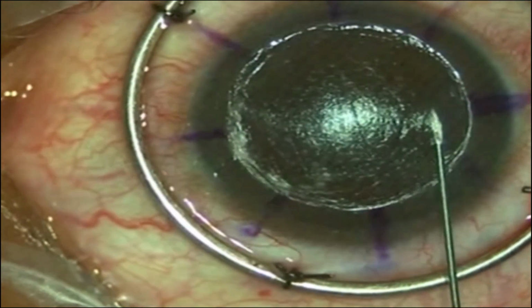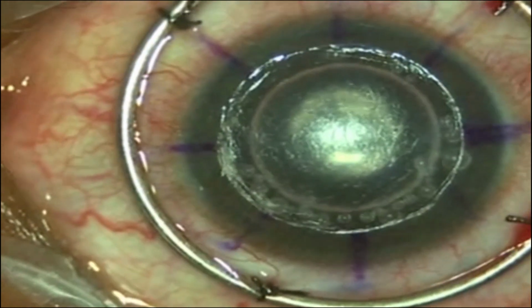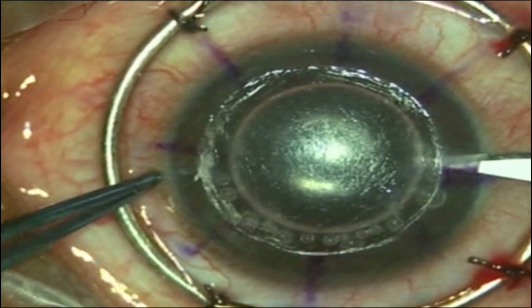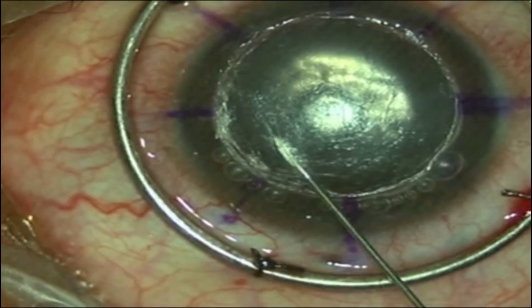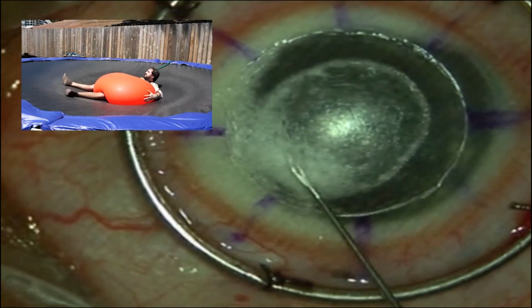The first injection, done using a 30-gauge needle, resulted in entry of the needle into the anterior chamber. Anterior chamber was decompressed by doing a paracentesis. With the second attempt from another site, a type 2 bubble was achieved with minimal corneal emphysema.